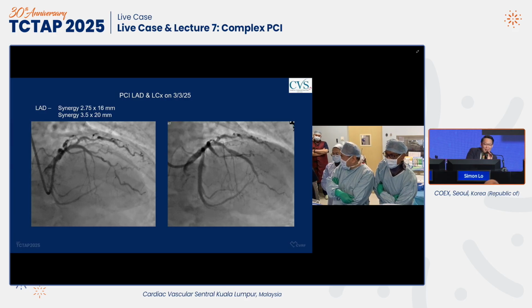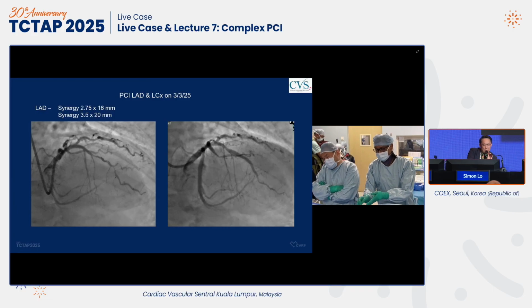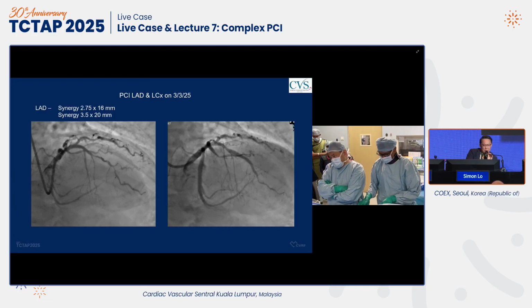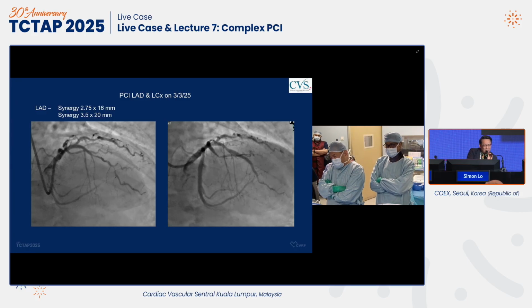Simon Lowe here. Yes, these are two experts on the monitor at the moment. I think one will have to go with imaging to see the degree of calcification. I think as he's only 59, as Dr. Alan Yeung said, we must not delete this patient off the option of future coronary artery bypass operation. So the distal lesion, including the PDA, it looks like there's some calcium there, but if one can get away with a DCB without putting a stent in, I think that's a good option.